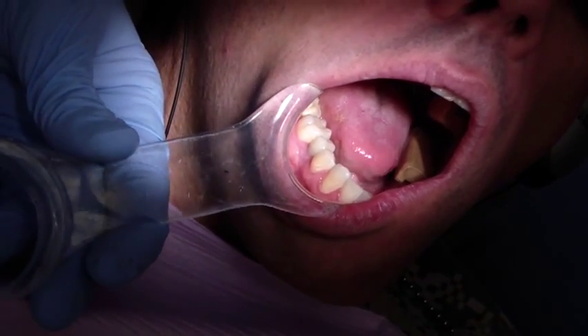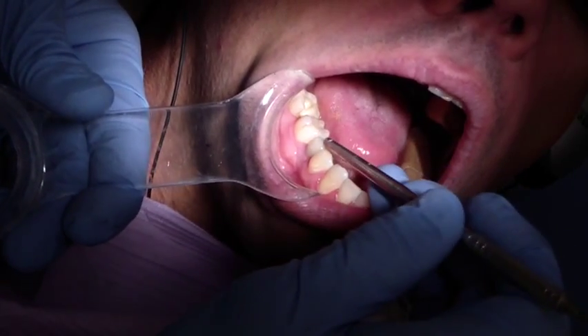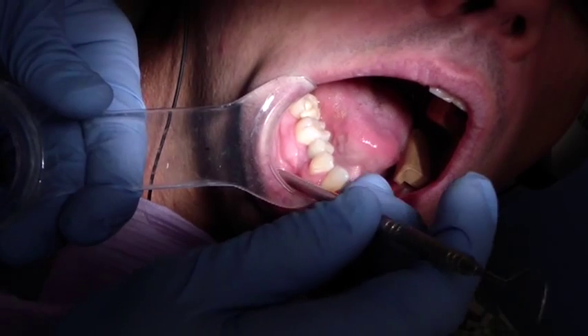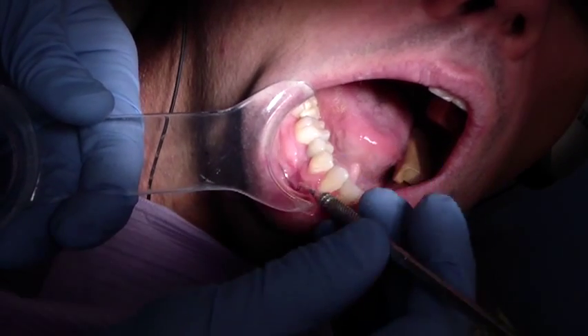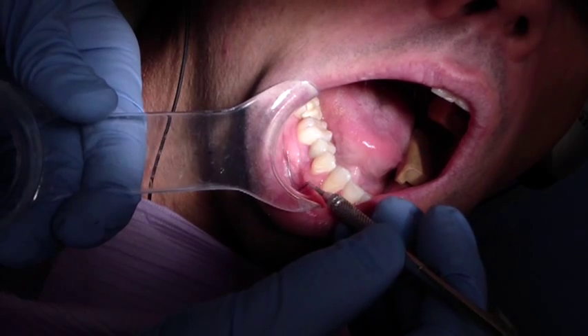Hi folks, Ashley at AllThingsDentistry.com. What I'm showing you here is an implant-supported crown. In this case, you can see that we now have some connective tissue before the buccal mucosa. I'm going to try to roll it here so you can see where our buccal mucosa starts.